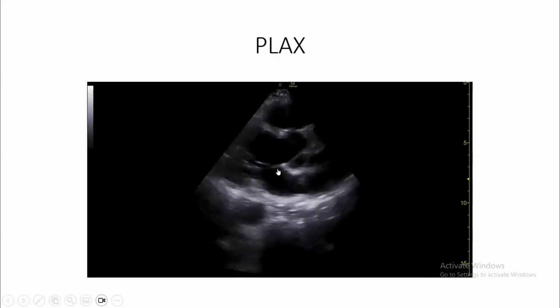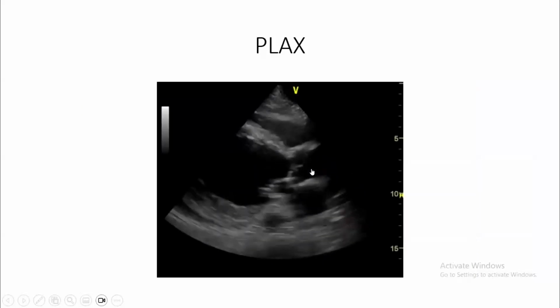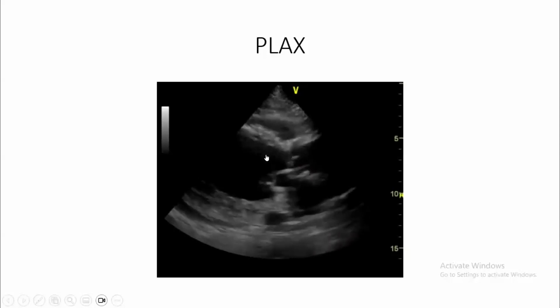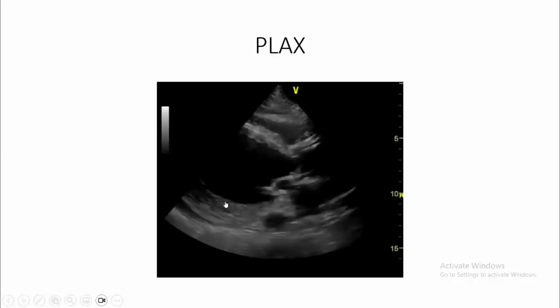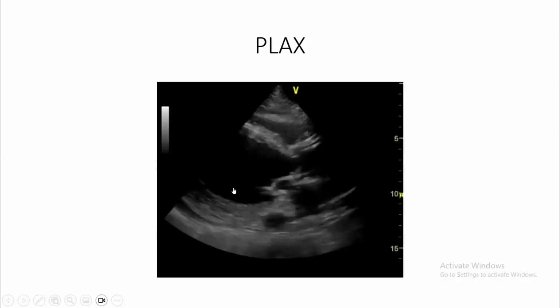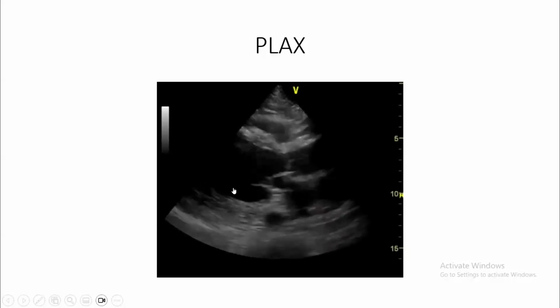No, this patient has good contractility, even a hypercontractile left ventricle. Okay, but what about this view? This is a parasternal long axis view. As you can see, the mitral valve is barely opening, not touching the wall, and there is dilatation of the left ventricle. There's no contractility or enlargement of the septum. This is poor cardiac contractility. The ejection fraction is less than 50%, maybe 30%.